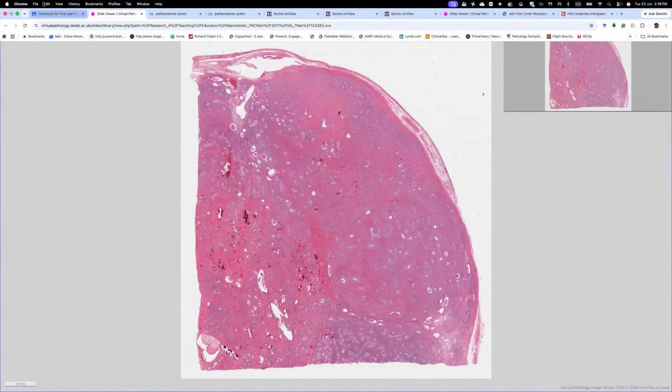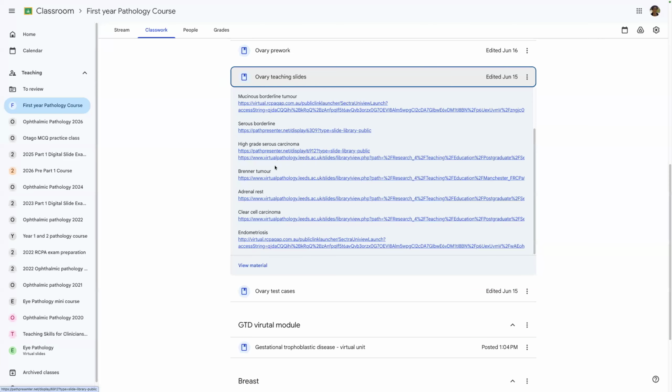Okay, next one. All right. How are we doing for time? I feel like I'm racing through. I am. Adrenal rest.